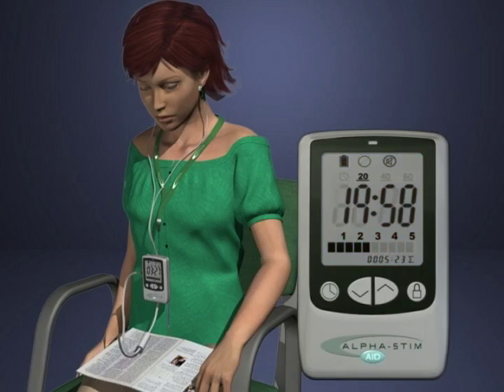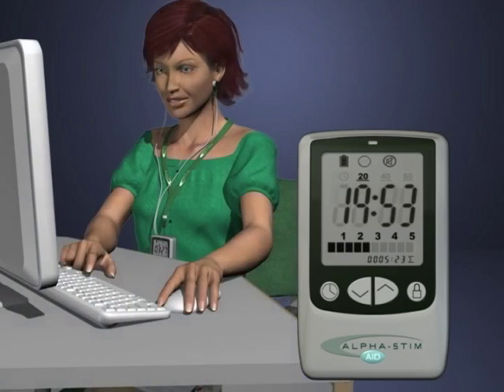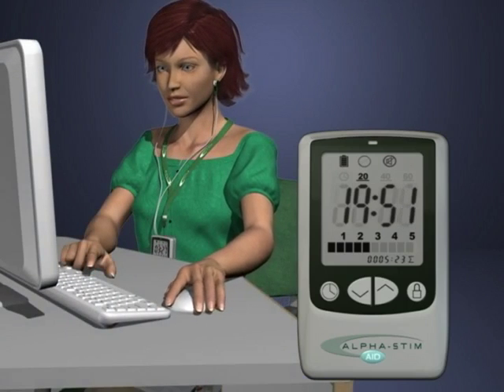Cranial electrotherapy stimulation may be used as often as necessary, but for most people it is best to treat between once a day and twice a week. Results usually improve and last longer with additional treatments.